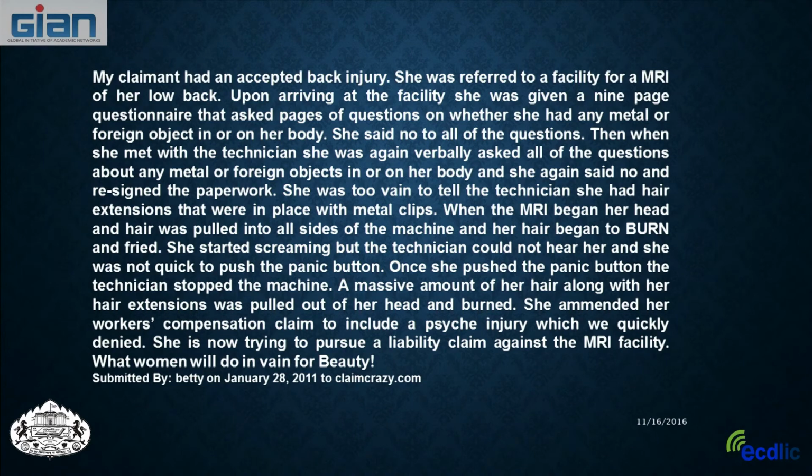But she was too vain to tell the technician that she had hair extensions that were placed on her head with metal clips. So when the MRI began, her head and her hair was pulled into all sides of the machine, and her hair began to burn also. So she says she started screaming. The technician could not hear.